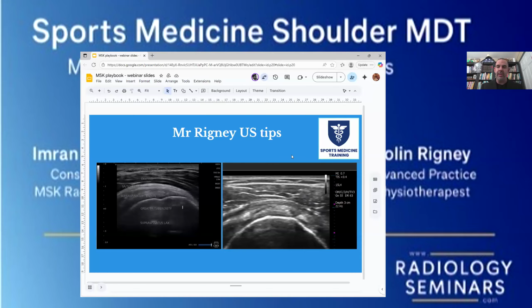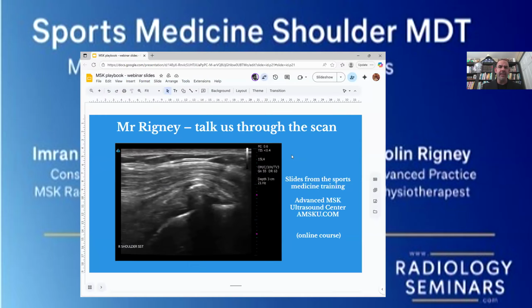So let's go ahead and advance here. All right, so calcific tendinopathy. Okay, let's walk through what this looks like. This can take a whole spectrum of appearances on ultrasound. Okay, so the one you're looking at here, this is a long axis image of the supraspinatus tendon.